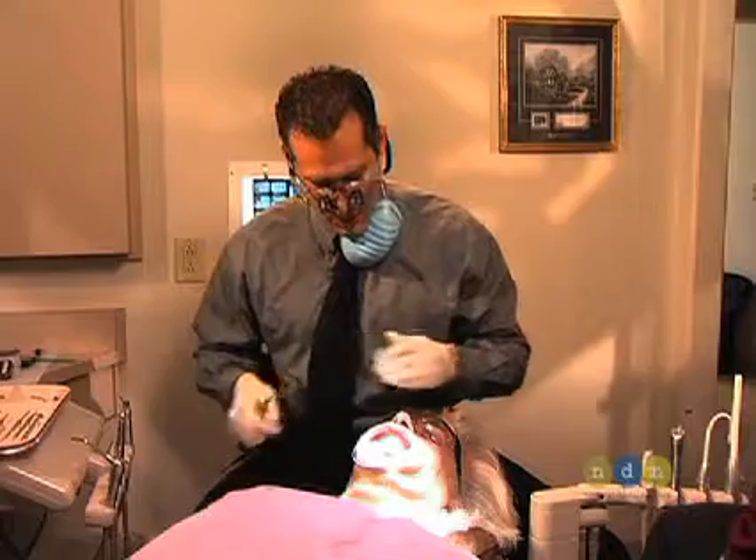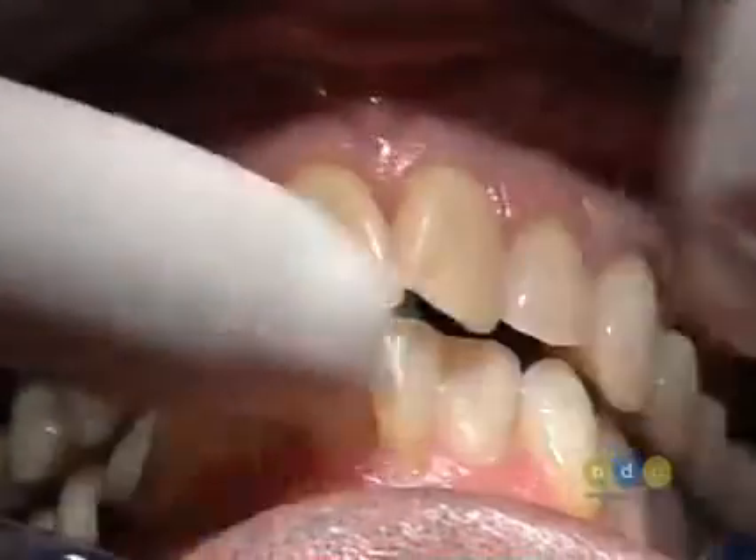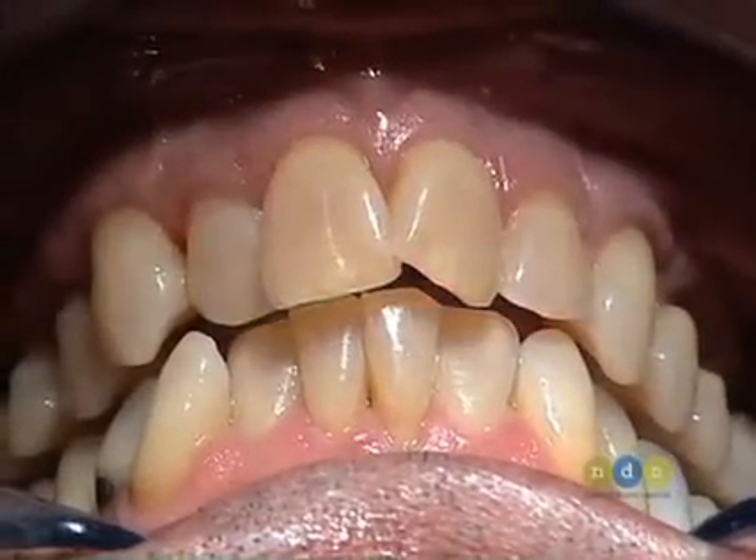Creating an ideal upper arch form means recontouring this arch form buccally and lingually. We're going to be bringing some teeth out, bringing some teeth in, making this V formation here very flat like we wanted in the final product.